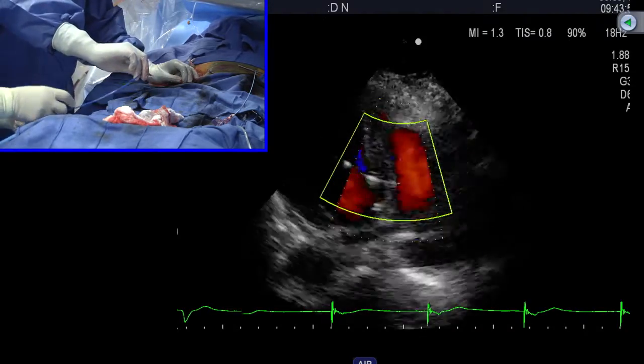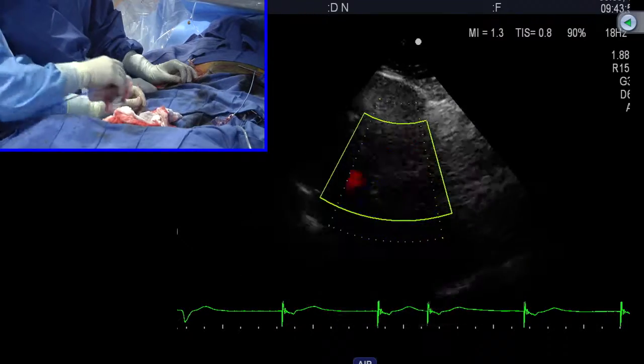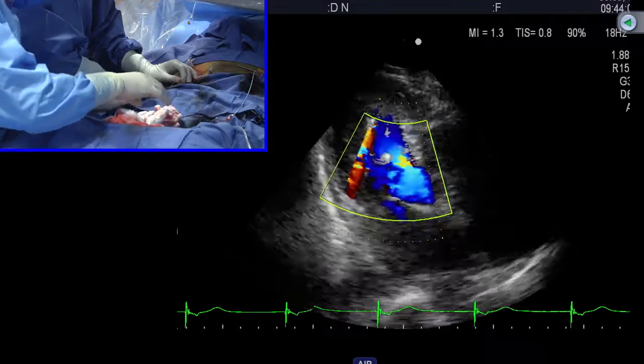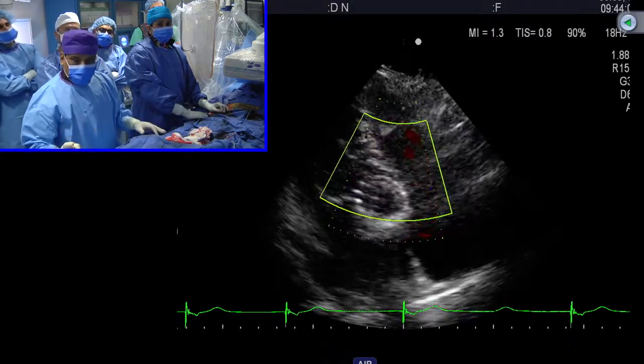Now if we need to go to a bigger one. You're overthinking the main. You've seen it expanded well. Bigger. Okay. So basically the balloon post-dilatation size is according to the minimum diameter of the annulus, right?